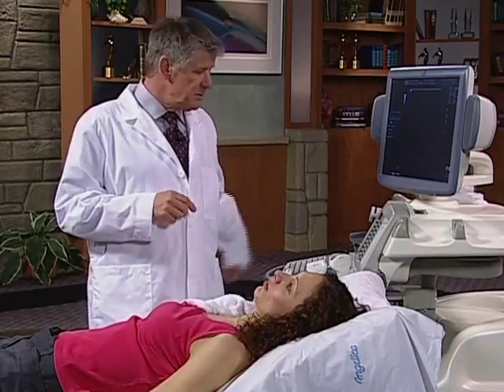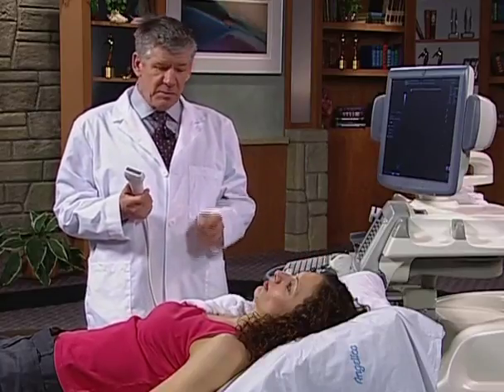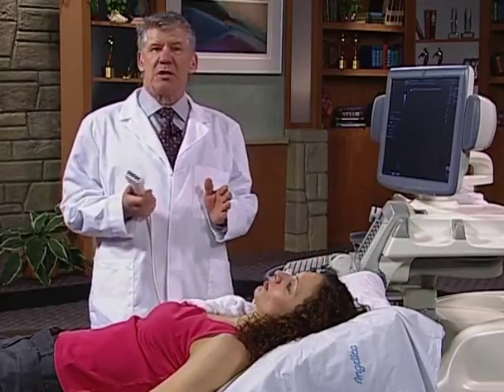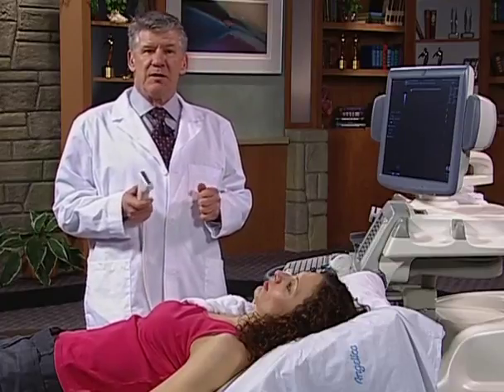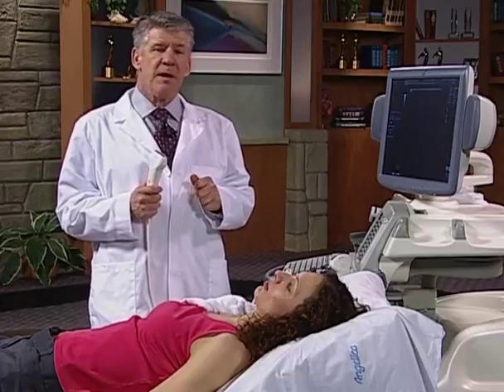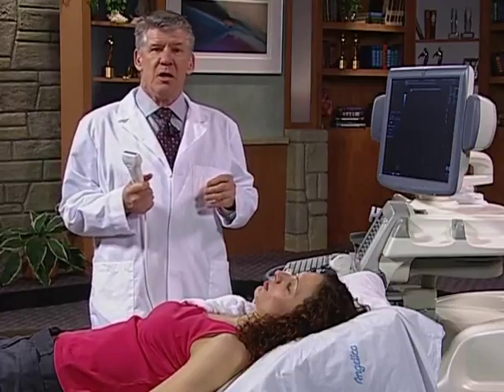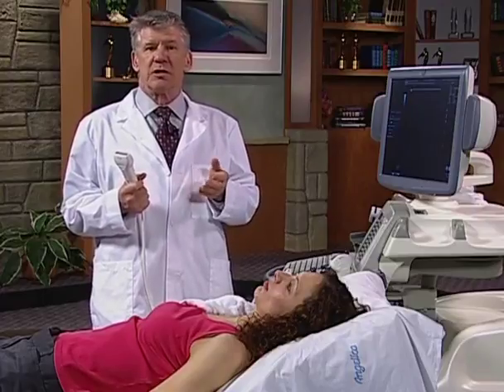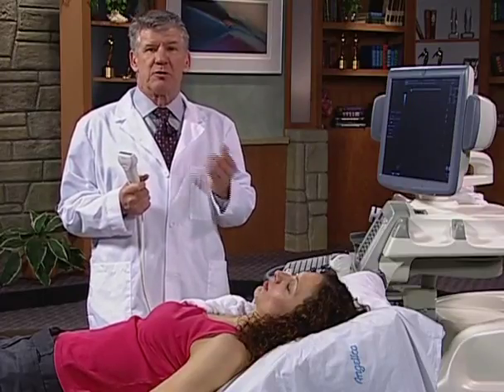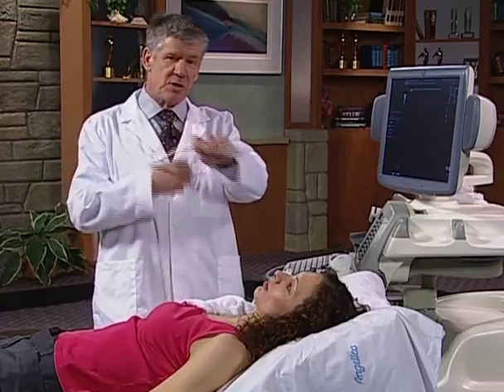A point that I'd like to make when we start out, in terms of transducer selection: because our model is so thin, I'll be using a higher frequency transducer. This, I believe, is an 8 to 12 megahertz or an 8 to 14 megahertz. On patients that are larger or obese, we may need to use a transducer in a range of, say, 5 to 10 or 5 to 12 megahertz, a little bit lower frequency to get better penetration.